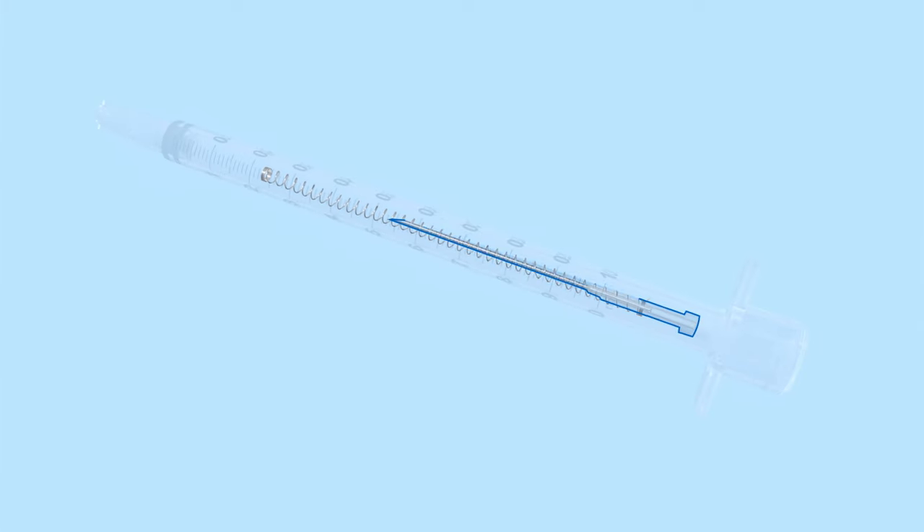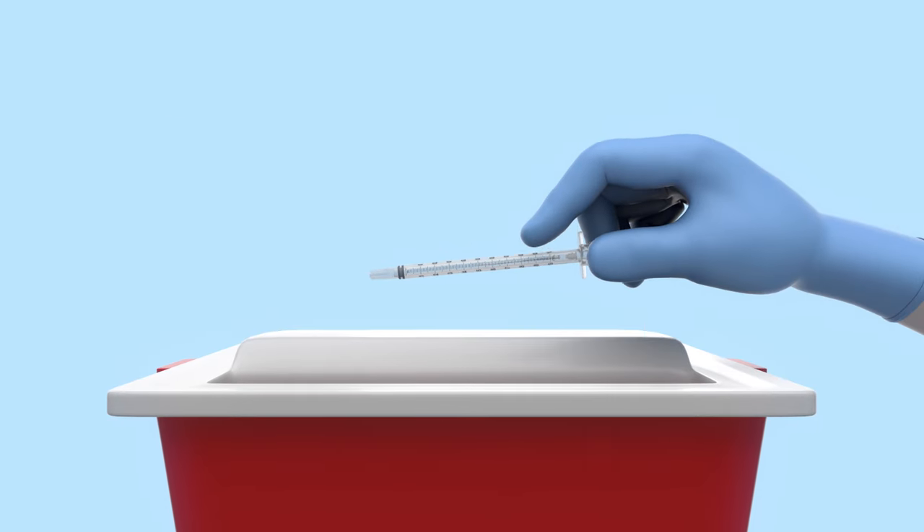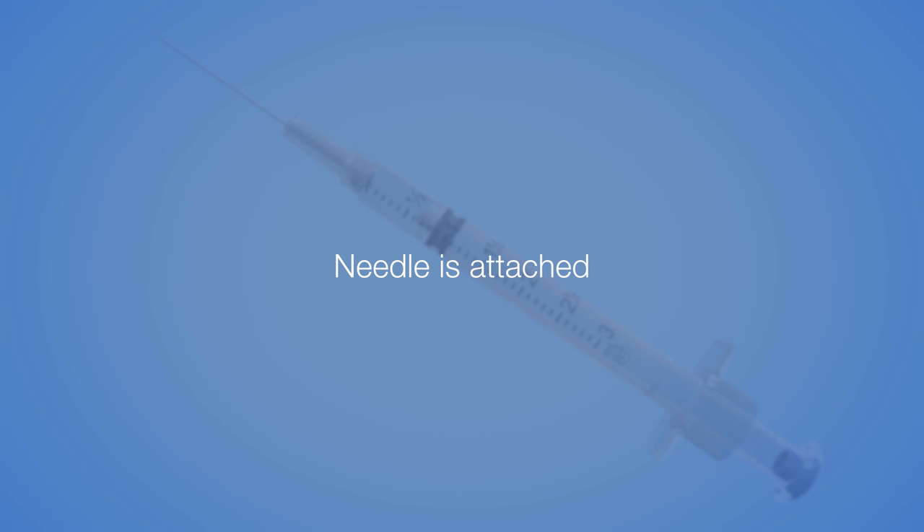The retracted needle and expanded spring will be visible through the syringe barrel. Dispose in an appropriate sharps container per protocol of your institution. Remember, needle is attached.